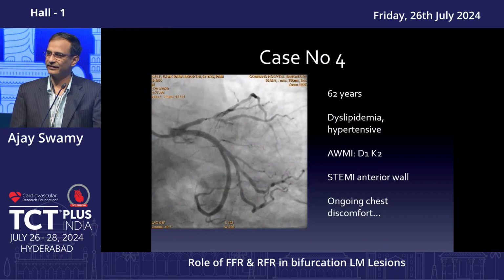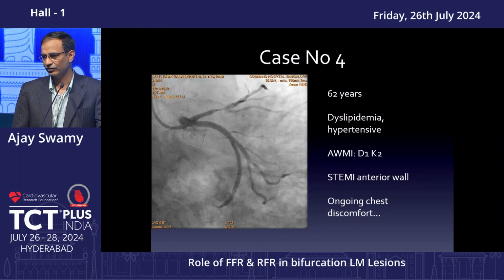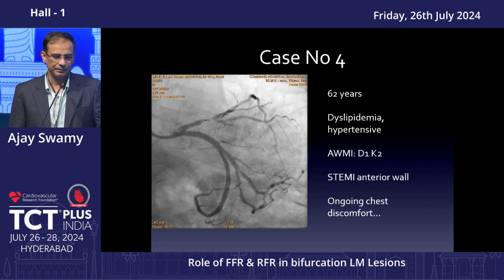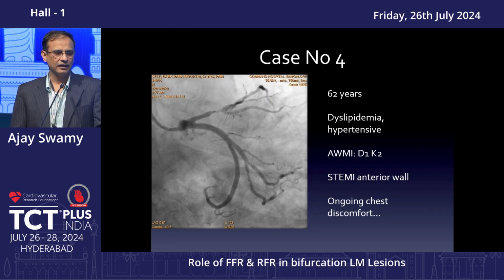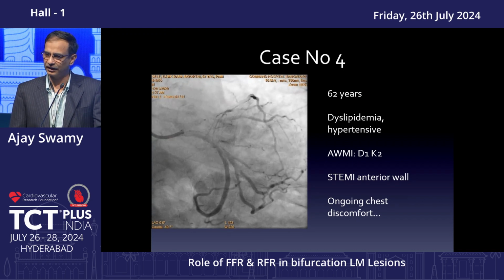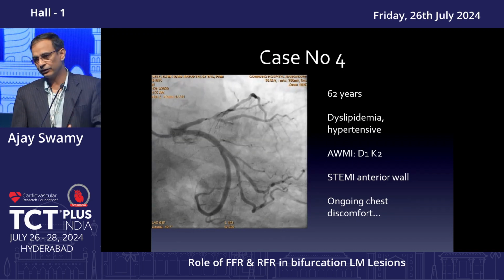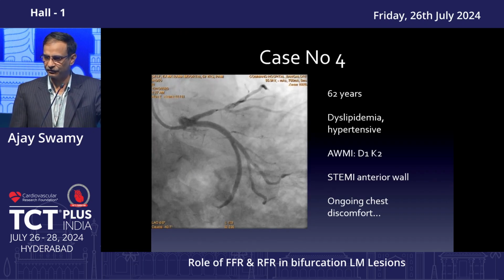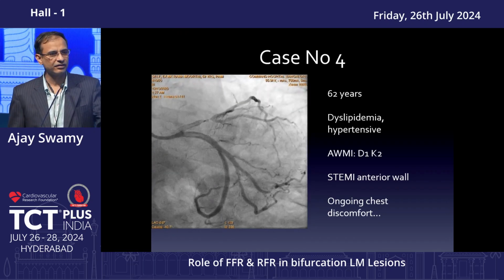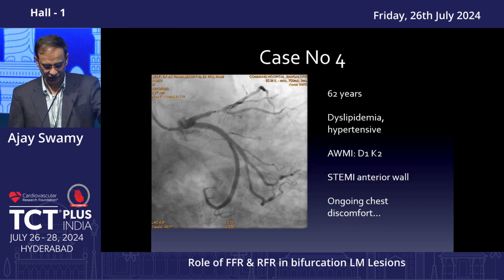So this patient was part of a study that we were doing in which we had a hypothesis that we were undersizing the stents when we did them in the primary, and we would bring them back to the table whenever they had an intermediate lesion in the other vessels. We didn't measure physiology at the acute situation because we weren't sure whether it was reliable. So we'd bring them back to the table, do an imaging to see whether we've appropriately sized the stent in the infarct-related vessel, and measure the physiology in the other vessels to see what kind of a result we got.